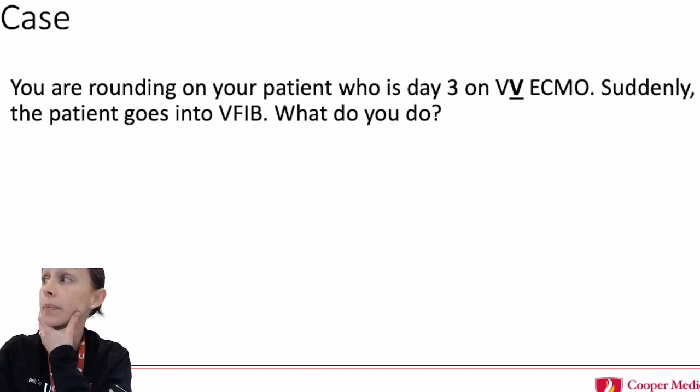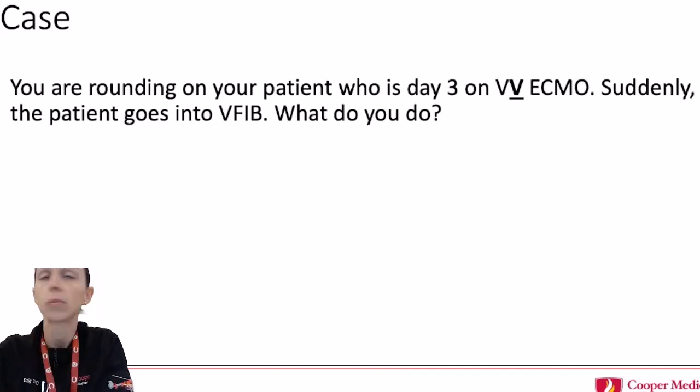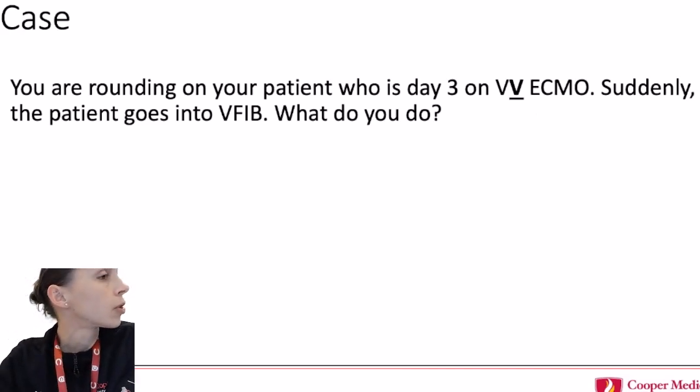But at the bedside, if the patient needs a central line or the dialysis catheter, you guys advocate, make sure we're positioning the patient appropriately to prevent air embolism. So for the IJ, putting them in Trendelenburg; for the femoral, making sure that the feet are down. And clamping off ports that aren't used. There are actually case reports of large air emboli, even just with central line insertions, so it can be kind of disastrous.